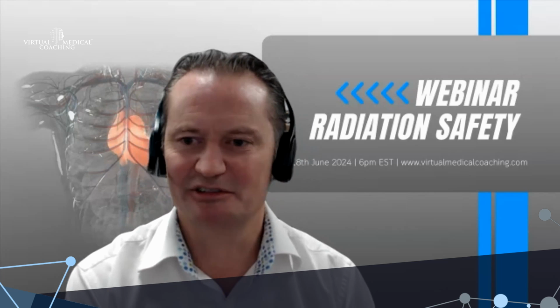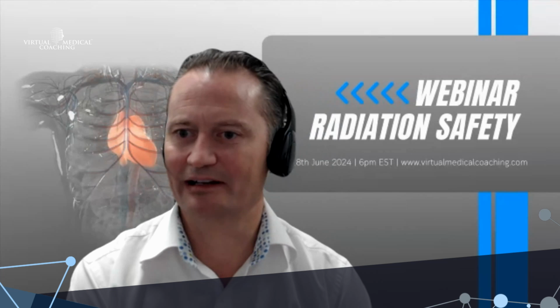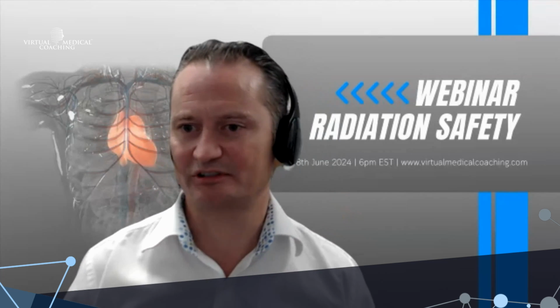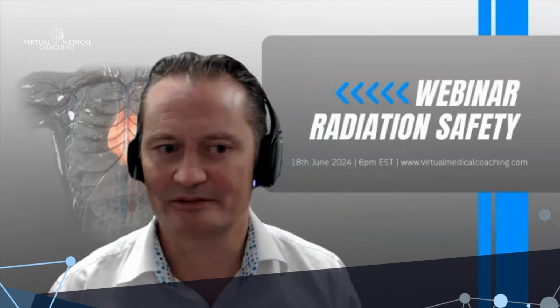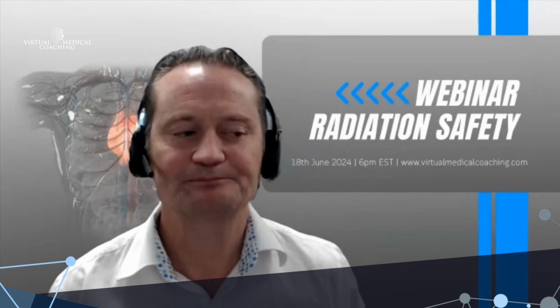Orange, you should be kind of stopping, and green is obviously a much safer environment. And so she was able to say, oh, this is just amazing for people who are training. And I was like, now we could all work that out. Like if the tube was always just in a PA position, anyone who'd gone through a radiography degree would be able to go, okay, I know roughly what's going on. We've got a series of concentric circles around the patient and we stay as far away as we can.